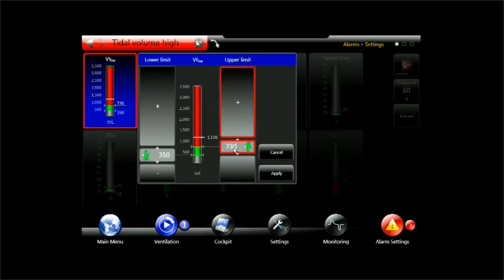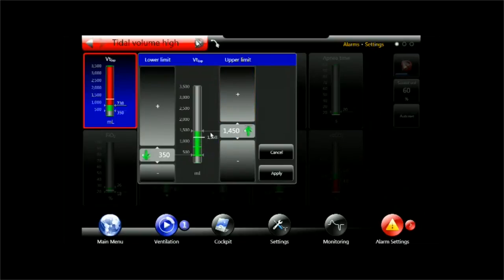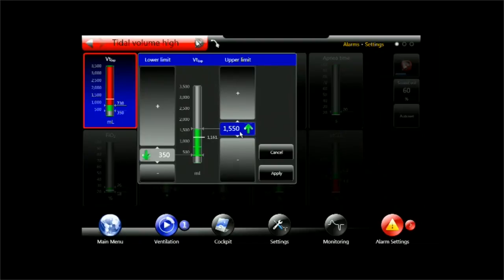I want to set the upper limit above the current value. So here we see the current value, 1160 milliliters tidal volume. So I want to be somewhat above that range.